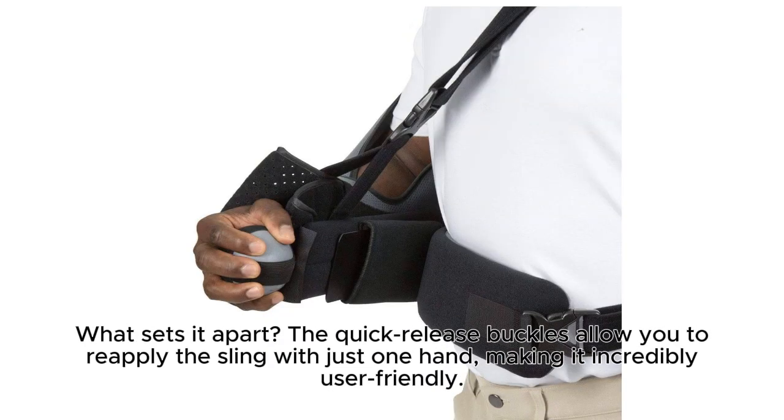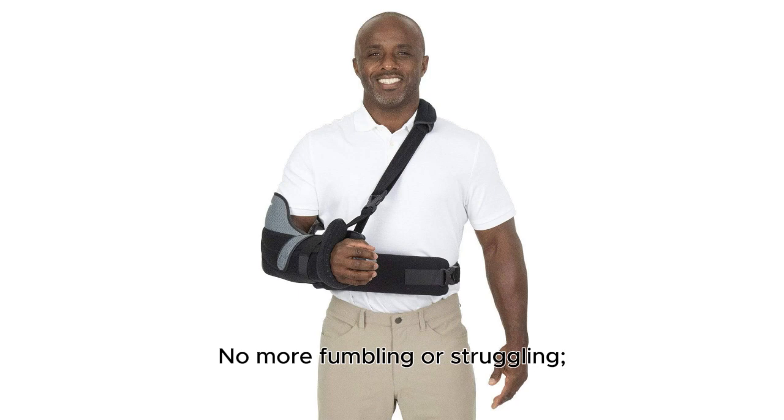What sets it apart? The quick-release buckles allow you to reapply the sling with just one hand, making it incredibly user-friendly. No more fumbling or struggling — it's designed for easy patient use.